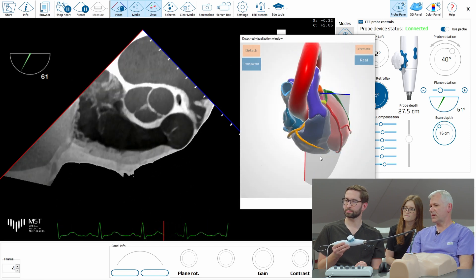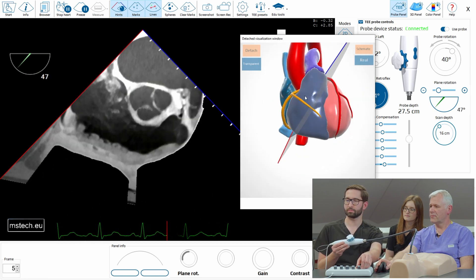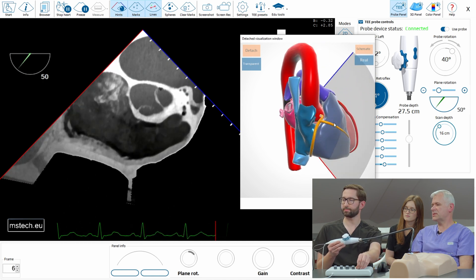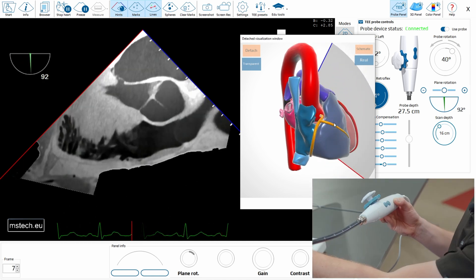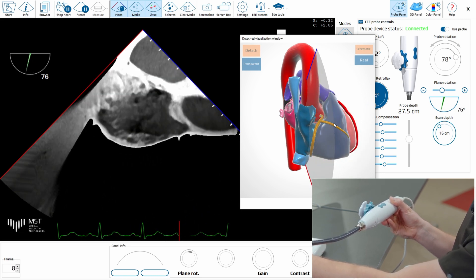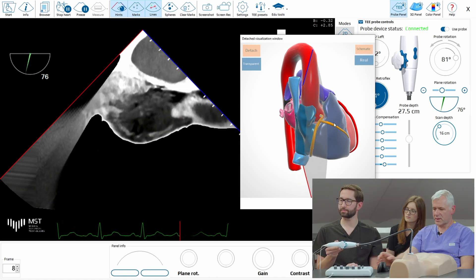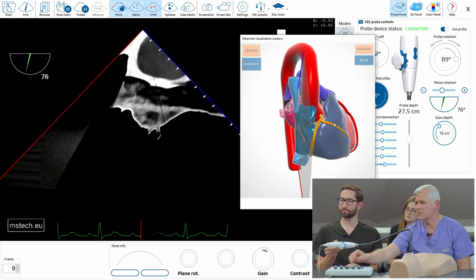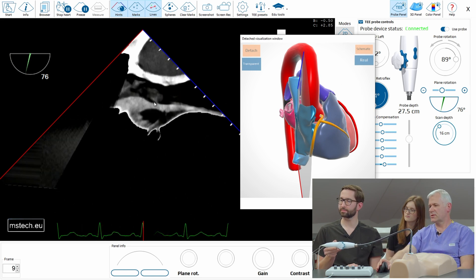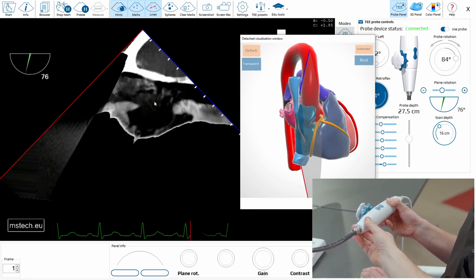The next one would be bicaval. You have to go to 90. And now rotate. Now we see the so-called banana view where we have the vena cava superior and inferior. Of course, if you rotate slightly, you will see more right atrium as well.